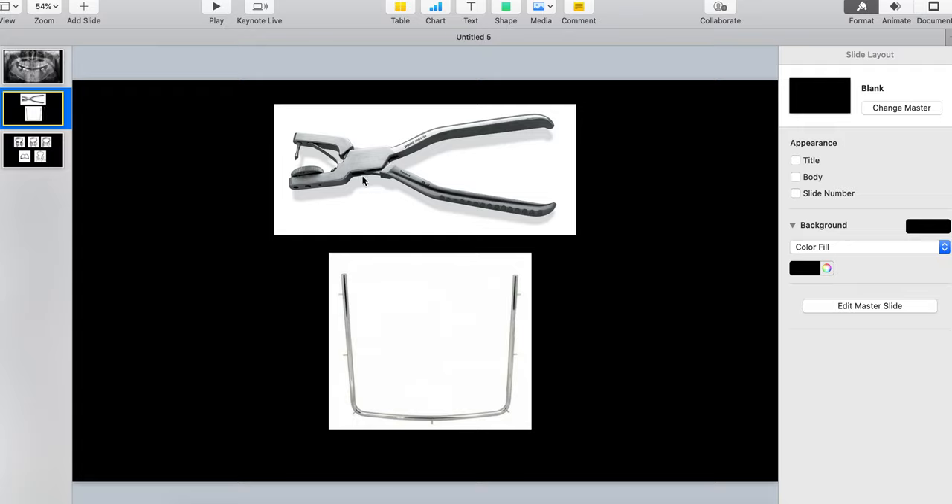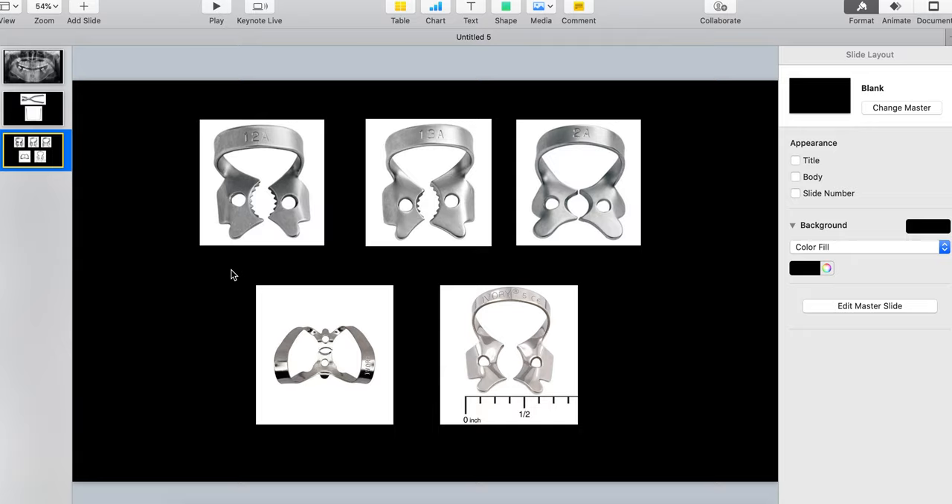All you need is a rubber dam punch — go more expensive than cheap because the really cheap ones don't last long. For the frame, it doesn't matter; you can use plastic since it's radiolucent, or just use whatever's sterilized in the drawer, whether metal or plastic. The five rubber dam clamps that have served me well over the last 20 years for both restorative and endo are the ones I'm about to show you.